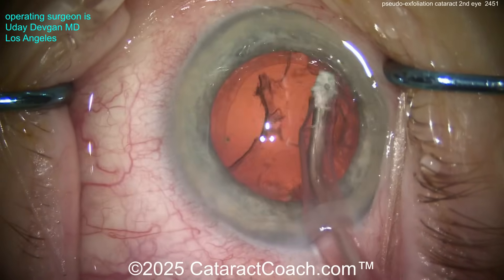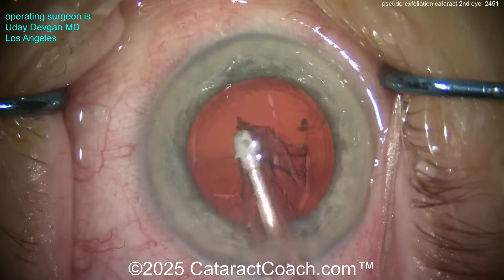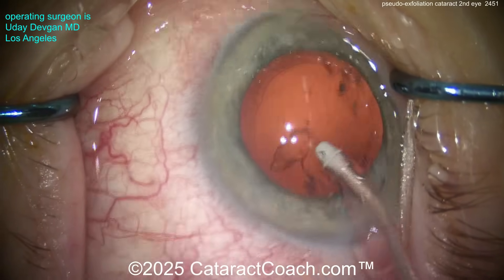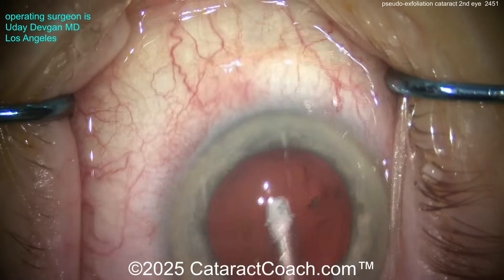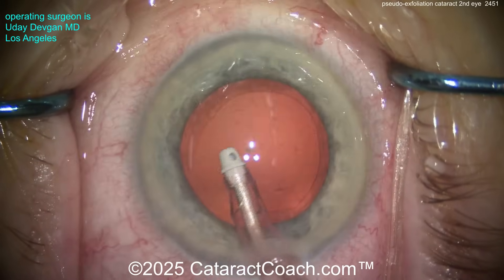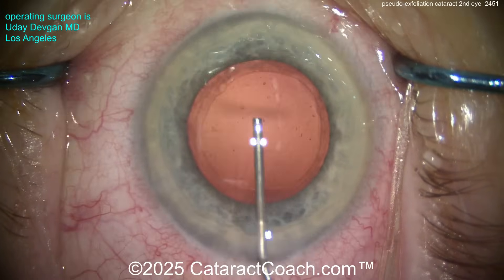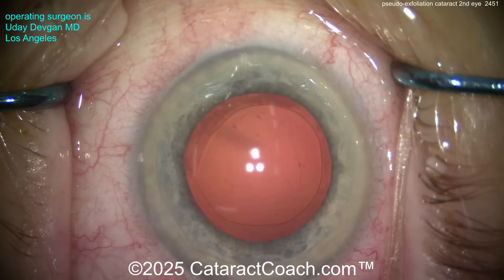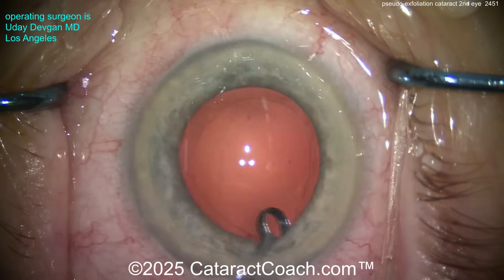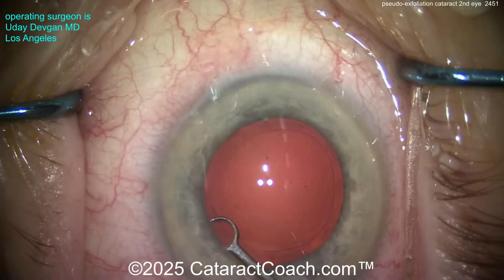I can hear cortex removal now — cleaning this up very nicely. Should you polish the bag? I think doing a capsule polish is probably a good idea. There's probably no harm in doing it, as long as you're relatively gentle. So why not polish the undersurface of the anterior capsule rim, hopefully removing some of those lens epithelial cells that end up causing issues later. I'm still debating in my mind — should we put a CTR in this eye or not? During the surgery, everything looked pretty stable, the capsule rhexis was torn very easily, there didn't seem to be much wrinkling or any zonular laxity. Let me just put the lens in first. A little capsule polisher, cleaning that undersurface of the anterior capsule rim — maybe I'm just making myself happy, but I think there's no harm in doing this and maybe there's a little bit of benefit.